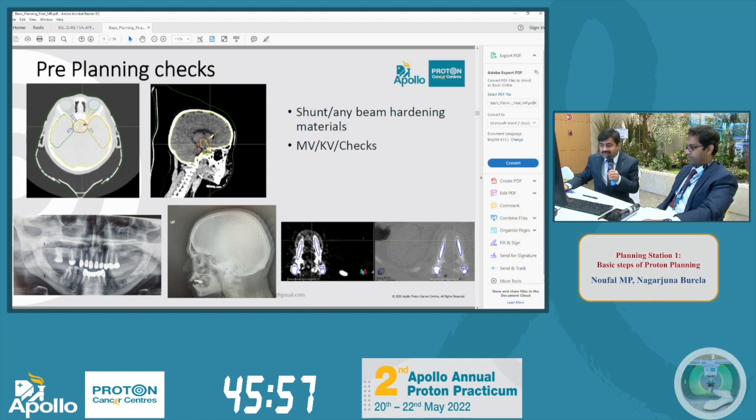So several things will sometimes block it. So it varies from patient to patient. So let's go to the case now, because we are going to show you a simple case. Okay, so over to Dr. Nag, who is going to tell you the case.